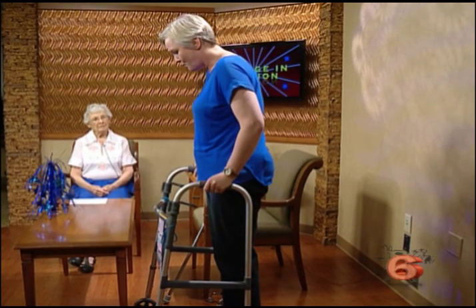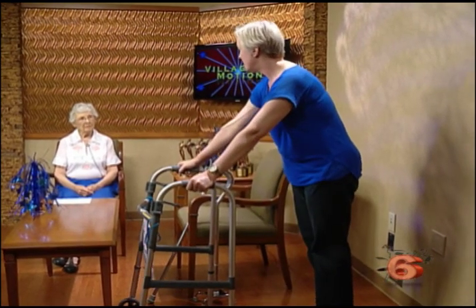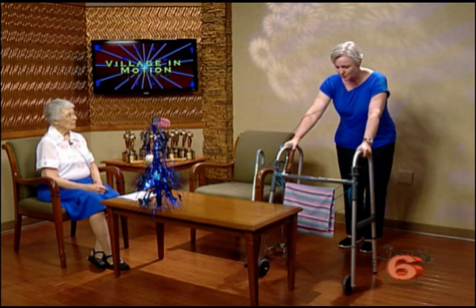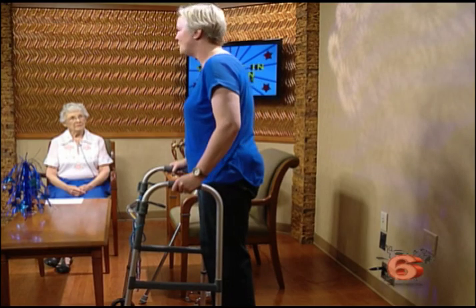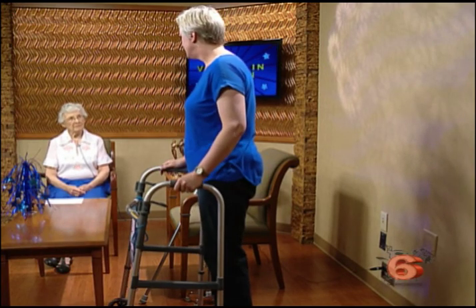When you're walking with the walker, you want to make sure that it's not way out in front like this. This is your safety net, as I call it. If you were to start to lose your balance, you want to make sure that you have the walker right here close to you, so you have that stability, in case someone's coming towards you and you lose your balance, or you're outside on uneven surfaces, where a lot of people really need the added support. So not only is the height important, but the positioning of the walker is also very important.